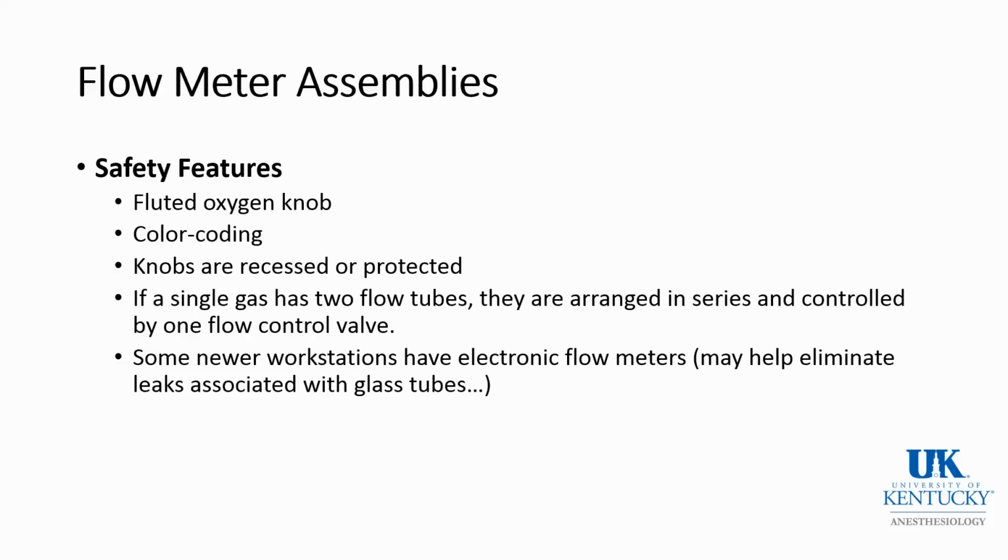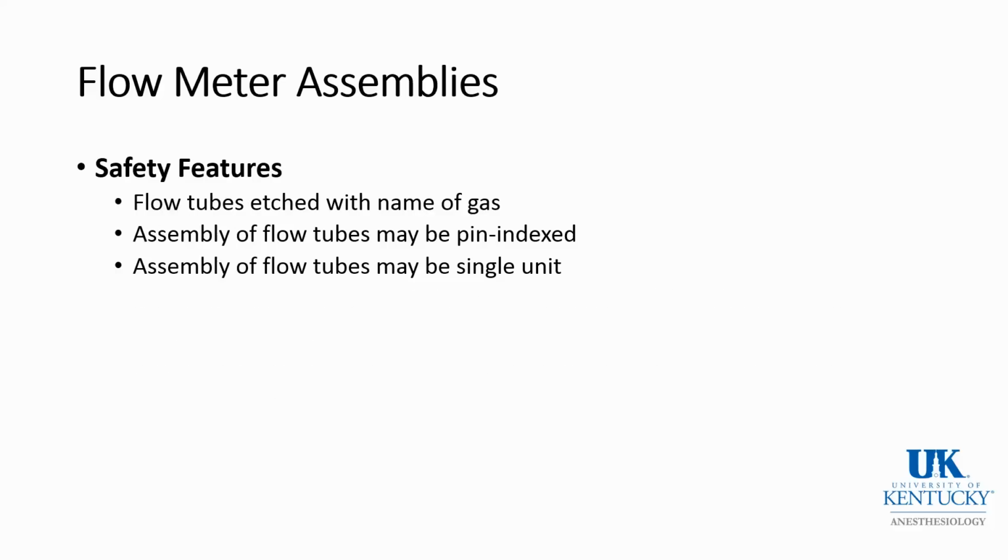One of the main reasons we selected the Apollo is that it has traditional flow tubes, and even in the case of a failure of the machine, there is a small glass flow tube and a float that tells you the total gas flow.